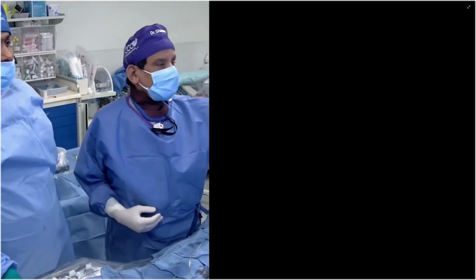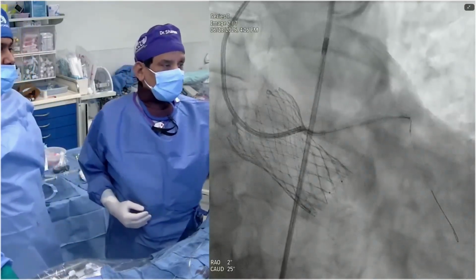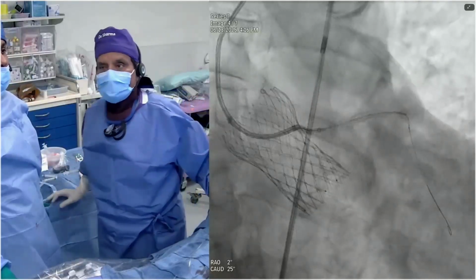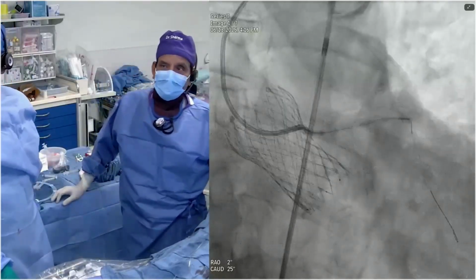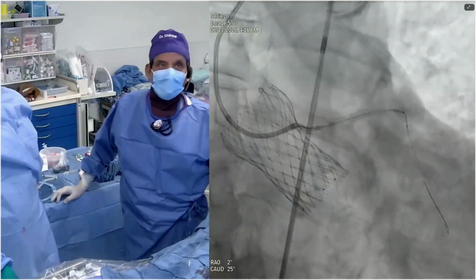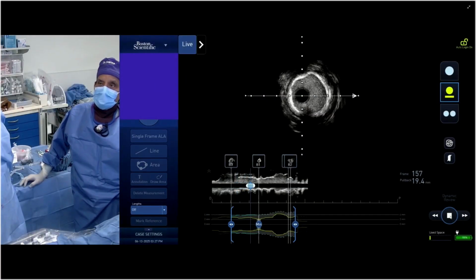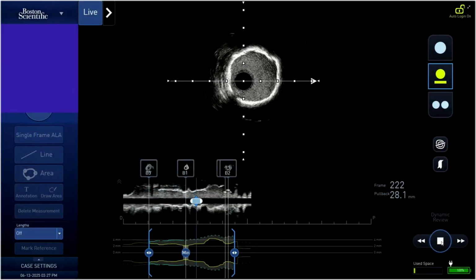And then we thought that it may be, we did the IVUS, that it's a left main. Kiski can show the IVUS run before we show the other cine. Okay, IVUS now, please. Okay, good. Start to work. So this is approximately a previous stent, some calcified ISR, borderline area.